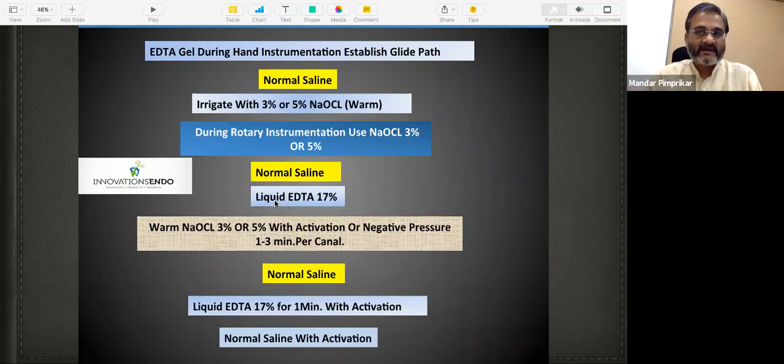Once your master apical file is completely done, you have to use warm hypochlorite separately with activation, the methods which I showed you earlier, either by sonic, ultrasonic, air sonic, or negative pressure. That is 1 to 3 minutes per canal.